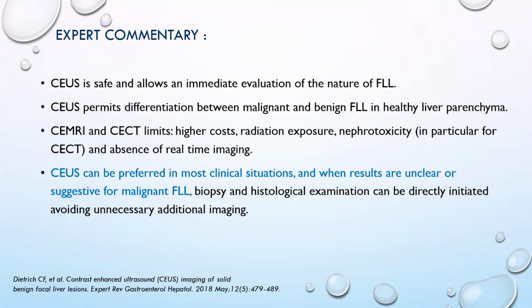It has advantages because it's not costly as compared to the other imaging techniques. There is no radiation, there is no nephrotoxicity. Actually, the contrast, you can use it also in patients that have renal failure, and it is the only one that gives you a real-time imaging evaluation. So actually, you can see in the arterial phase what happens with the contrast when it arrives in the liver and in the focal liver lesion.